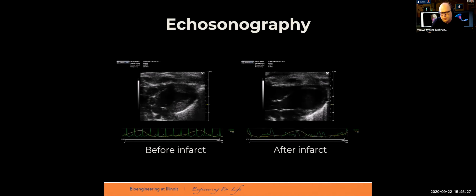Well, with the ultrasound, definitely we can do ultrasound imaging and calculate the volumes of the heart at different phases of the cardiac cycle. So as the heart beats, the technician, the ultrasonographer, measures the volumes and then, using the formula which I showed in the previous slide, calculates the ejection fraction, knowing the minimum and maximum volume of the heart.